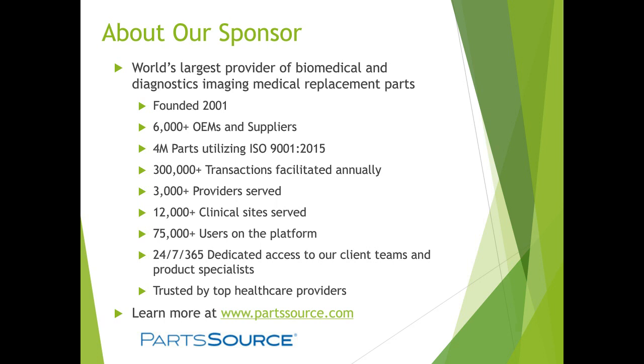Great. And have you started utilizing AEM in your management plan? And if yes, how successful have you been? Yes, we have. We've been, I believe, very successful in it. So like IV pumps, we do not do PMs on our IV pumps, and I have a couple thousand of them. That's a lot of time that we're using on them. We tend to see 35%, 30% of them every year anyway, just based on the type of pump we have, the use that they're getting.